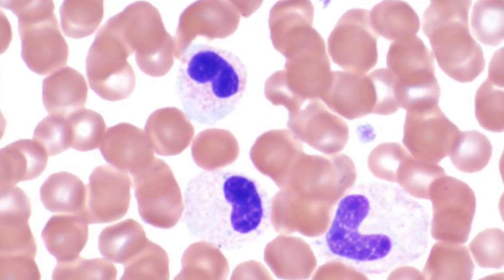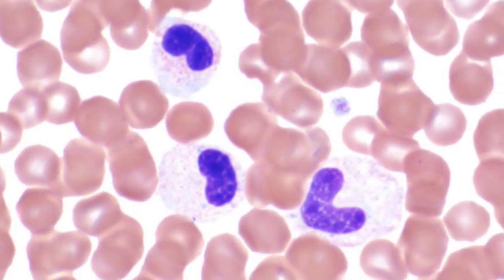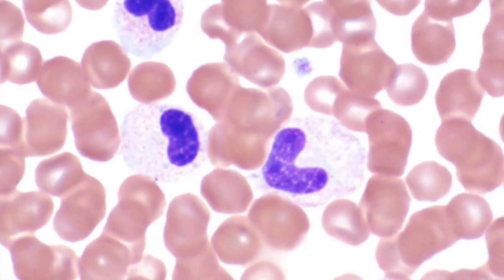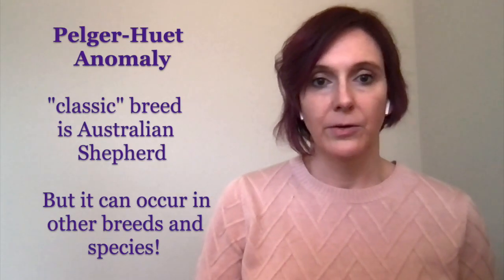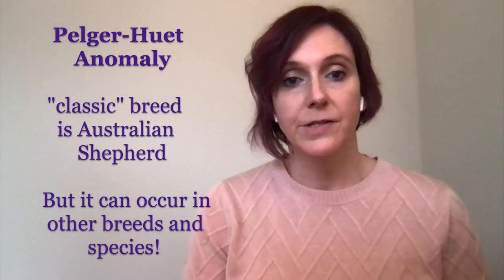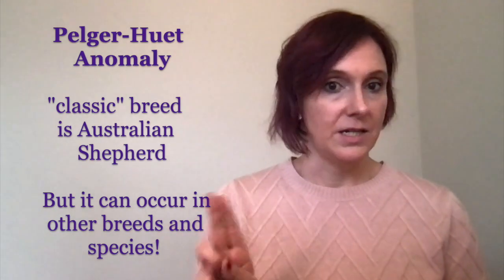The interesting part of this whole Pelger-Huët thing is that the eosinophils, as well as the basophils, though we don't really see them out there, but the eosinophils will also have poorly segmented nuclei. Our classical breed for Pelger-Huët is the Australian Shepherd in dogs. With that said, it can happen across many breeds in dogs. I've seen it in cats.